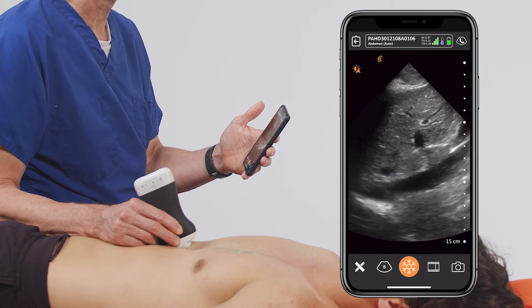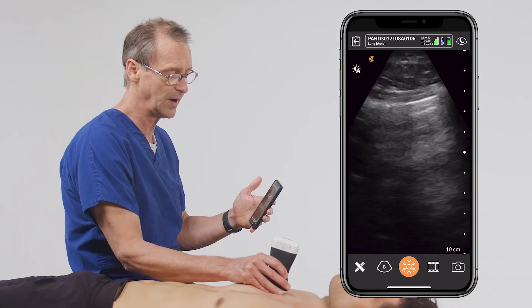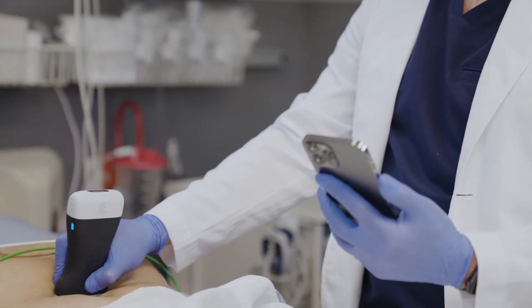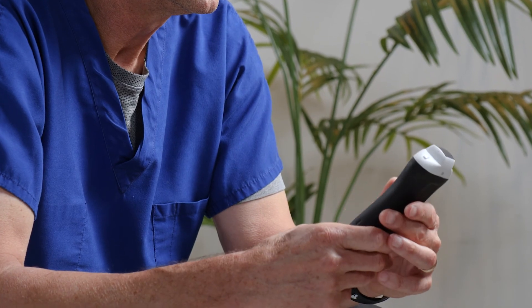For me, I tend to use a phased array almost exclusively because I can cover the chest, the thorax, the abdomen, the retroperitoneum, and the pelvis, and at least nudge myself in the right direction. If I need to get a better study or a higher quality image, I can go to another transducer and get that image. But most of the time, all I use is this — with a few exceptions, like peripheral access, but most of the time this is all I have in my pocket.